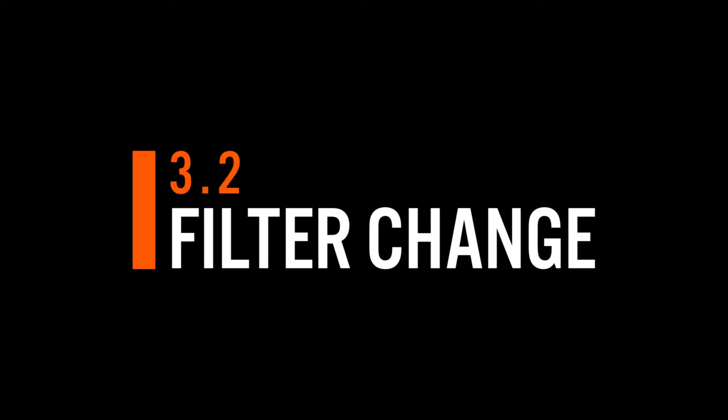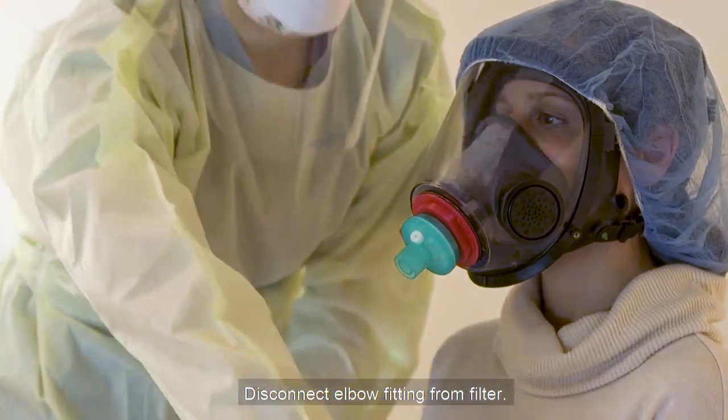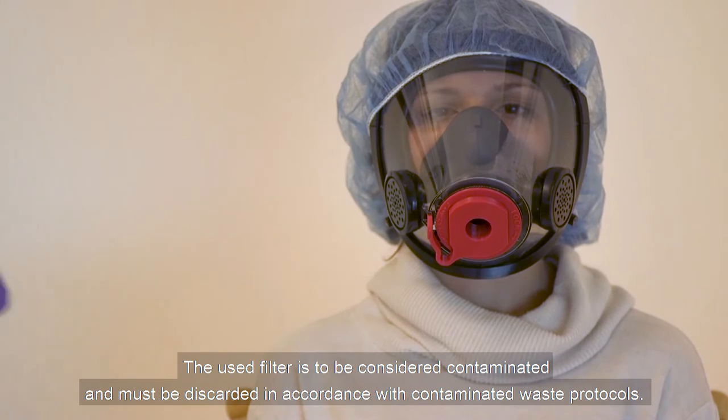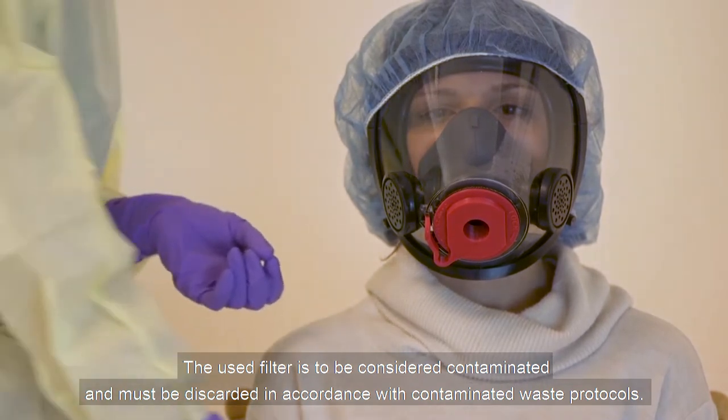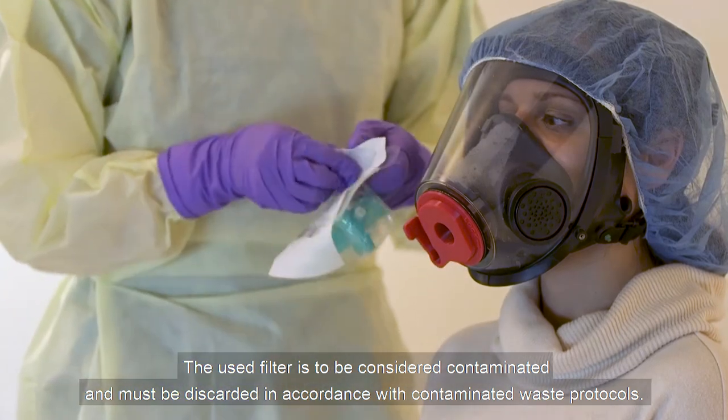Filter Change. Disconnect the elbow fitting from the filter. Remove the filter from the mask adapter. The used filter is to be considered contaminated and must be discarded in accordance with contaminated waste protocols.